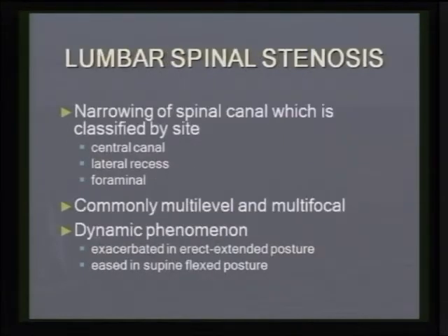Finishing off now with lumbar spinal stenosis. Now this represents a narrowing of the spinal canal, which can be multiple etiologies, but we're going to speak only about that related with degenerative disc disease. Again, it's classified according to its anatomical location, into central canal, lateral recess, and foraminal, but it's commonly multifocal and multi-level. Very important again then on MR to identify all of the sites and describe them all in your reports.